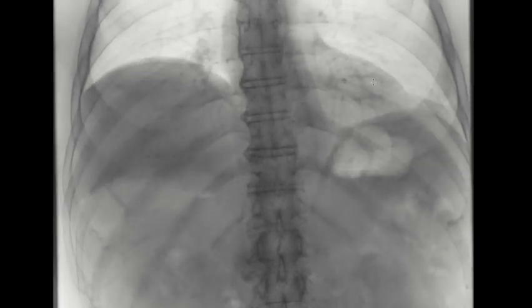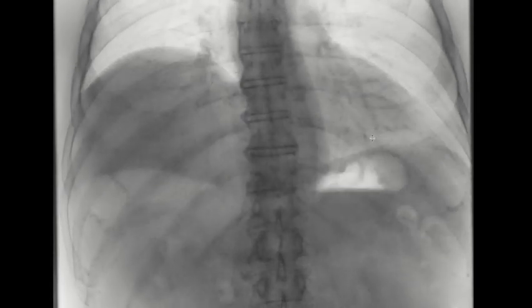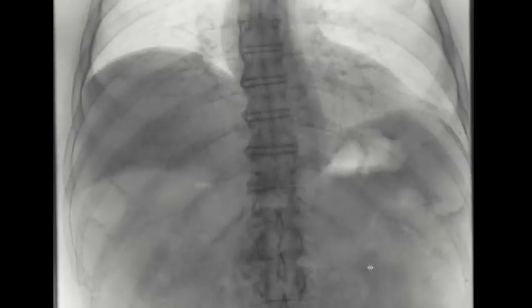The left hemidiaphragm comes down with inspiration and back up with expiration. You can see that based on the instructions given to the patient, the rate of inspiration and expiration is changing, which is why as I scroll through you can see the diaphragm jump.